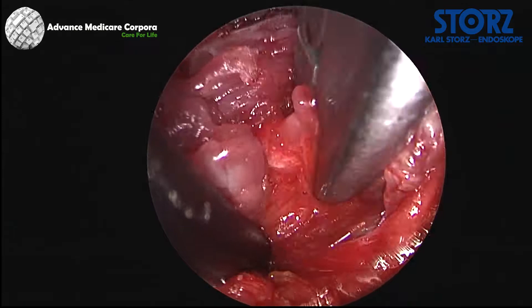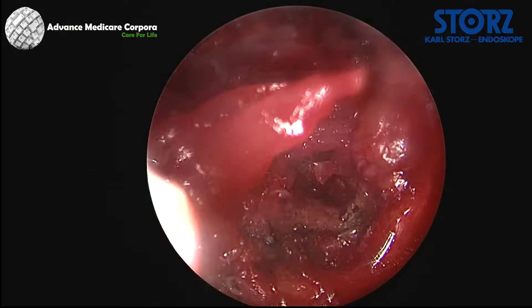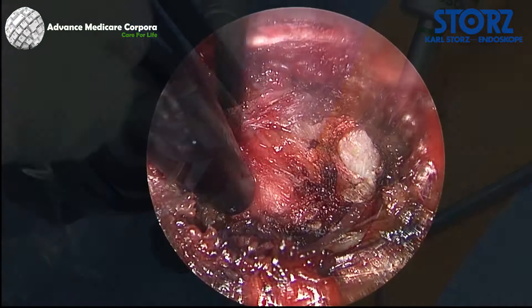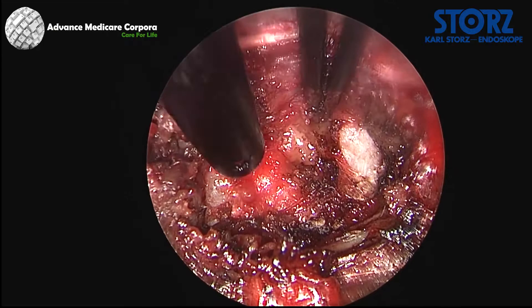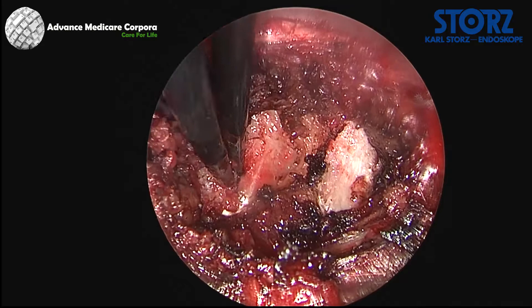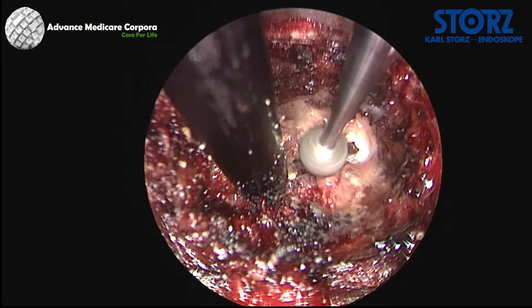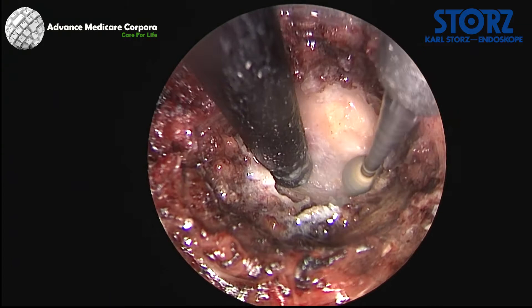Similar to the lumbar approach, the cervical approach usually starts by removing the soft tissue remaining on the lamina. Minor bleeding can be controlled with bipolar diathermy. Localization of the facet joint is critical for decompression of the nerve branch in the neural foramen. To expose the facet joint, the medial part of the joint is resected with a diamond burr and a Kerrison punch.